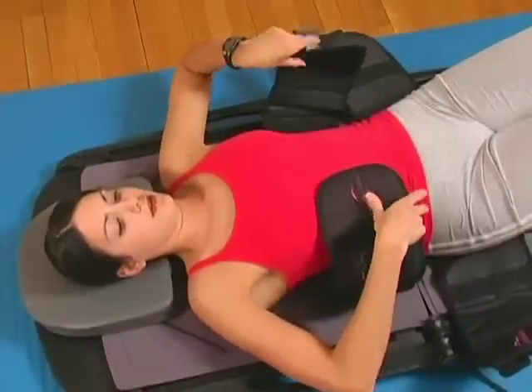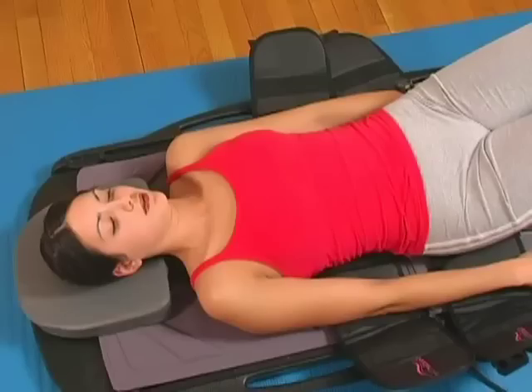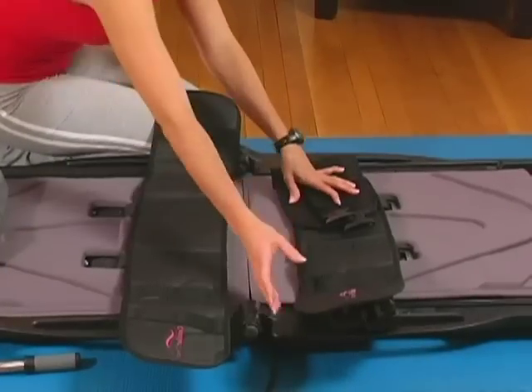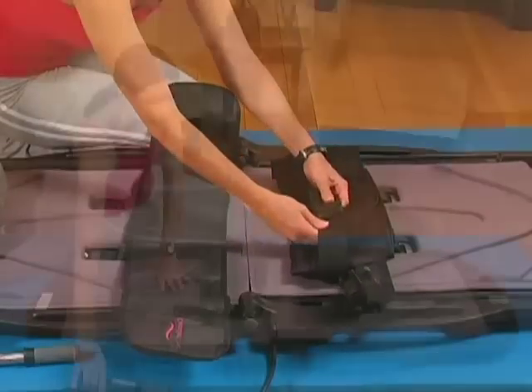Release the adjustable straps and relax for a couple of minutes before removing your body from the ComfortTrack lumbar traction device. Before returning the ComfortTrack lumbar device to the custom case, just refasten the buckles. No disassembly is required.